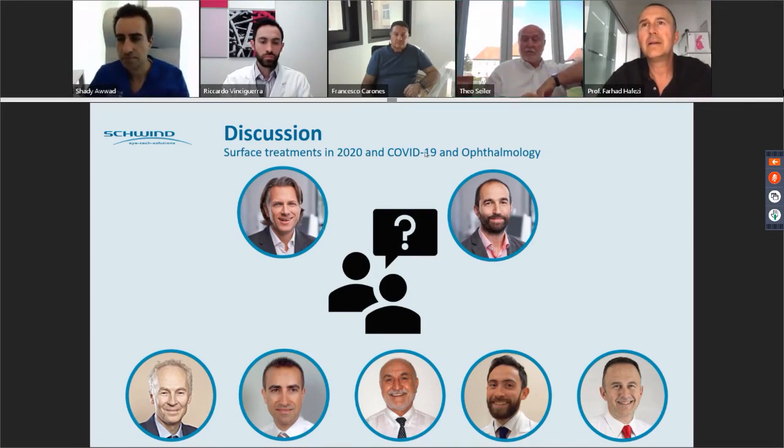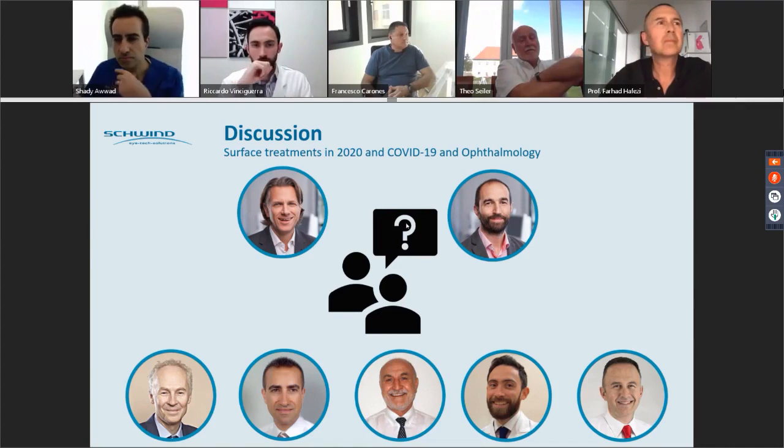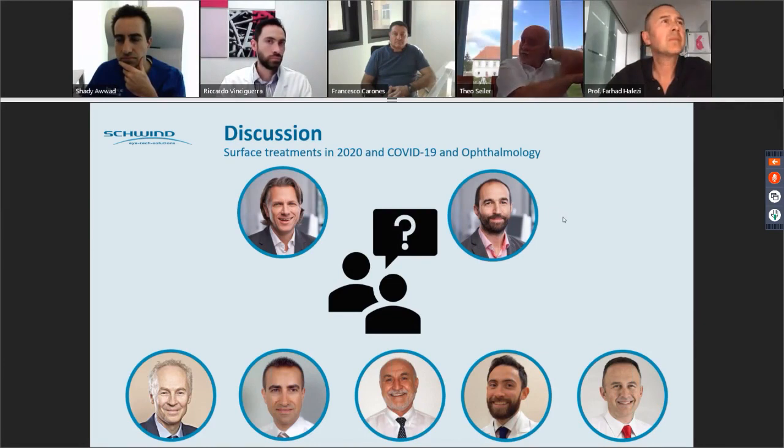The first one is for Bruce Allan. With irregular corneas in particular, it is difficult to get good quality wavefront scans. And in particular for keratoconus, the cone may not be central, and the wavefront is limited by the pupil. So how do you cope with the potential that the wavefront scan does not encompass the cone in its entirety? The last point is quite easy to speak to. The part of the cornea the patient is seeing through is the pupillary area, and that's the area we want to sample and treat with the wavefront scan.